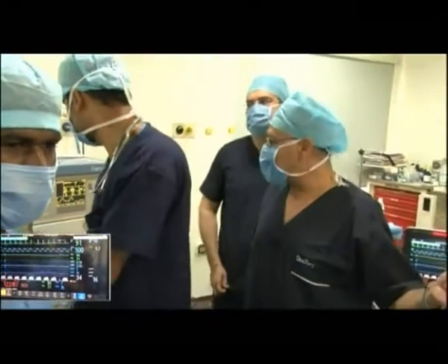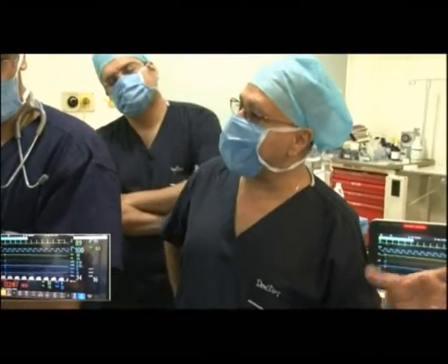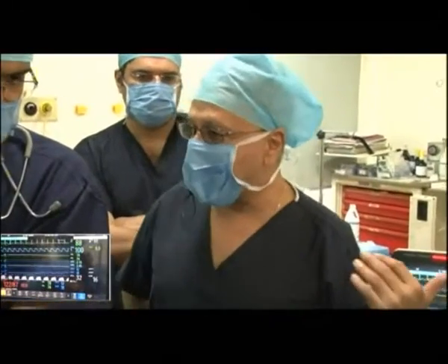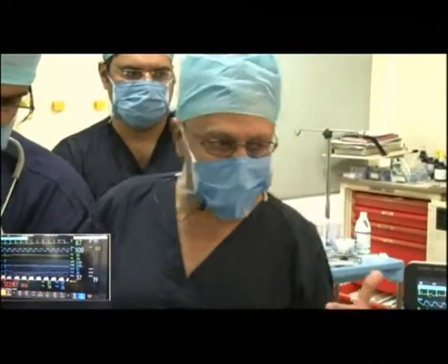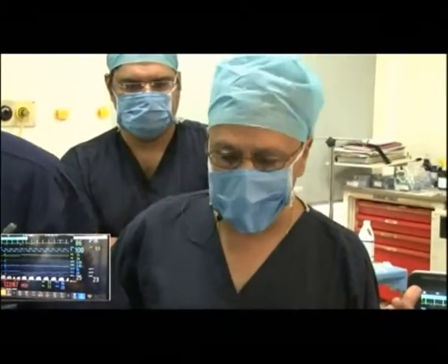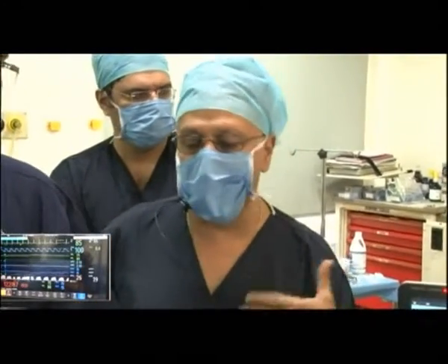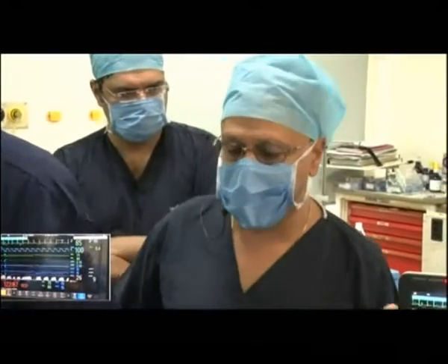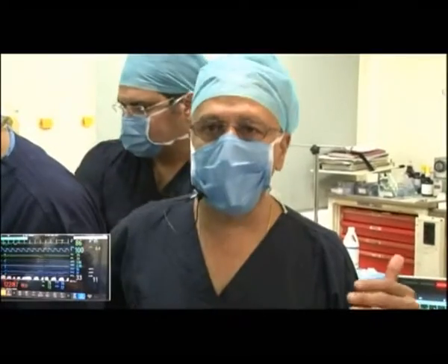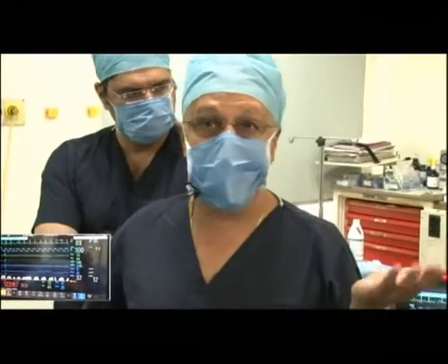From a ventilation point of view, we will set the ventilation at about 7 mL per kilogram ideal body weight, as we talked about, say maybe 500 mL, and that's the tidal volume, and then the rate will be set to achieve an end-tidal concentration of CO2 around 40. Again, I'm going to compare and contrast what we used to do once upon a time and what's been recommended from recent research. Once upon a time, we would maintain the end-tidal CO2 around 30 to 35. Now we are recommending that you keep the end-tidal CO2 slightly higher.